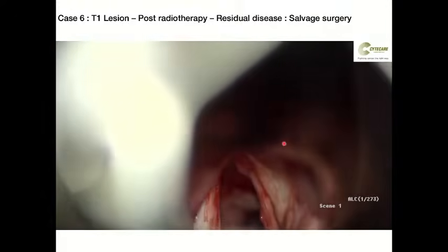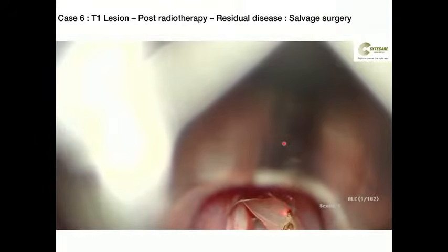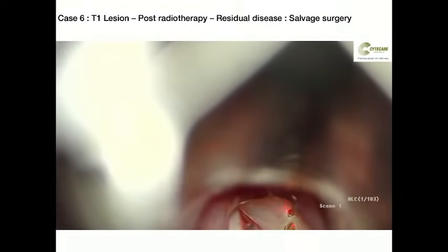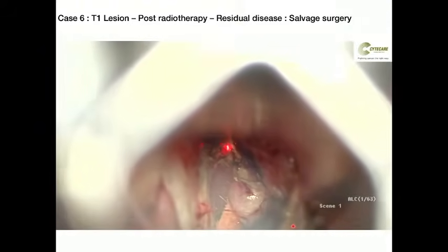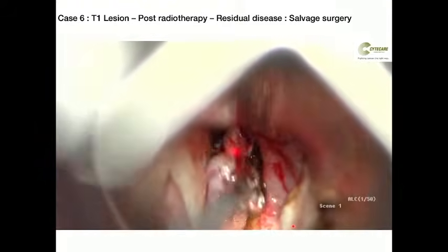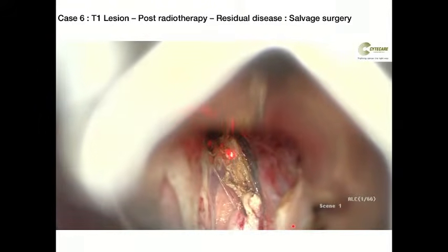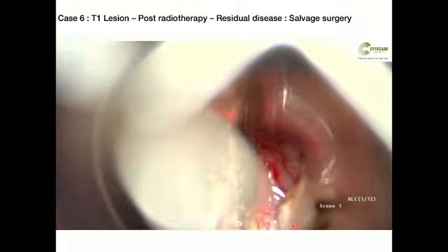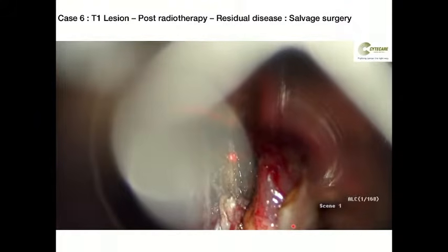So this is the scope that we prefer, DIDO. I think this is the one scope, sir, you have to procure when you're doing transoral laser surgery, DIDO and a suction fume. So we had a lot of trouble with the suction. We could have seen that in the first case. So you need to have a simple suction. You can have the Storz laryngoscope, you can have a Kalelkar suction, like we can do the Indian jugaad and make it better, right?